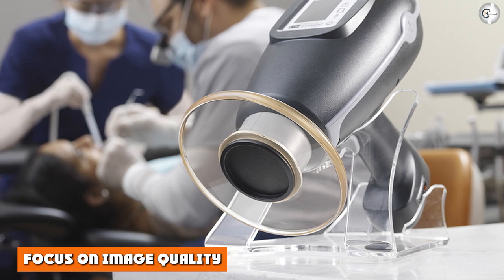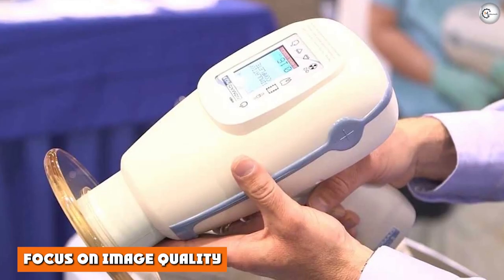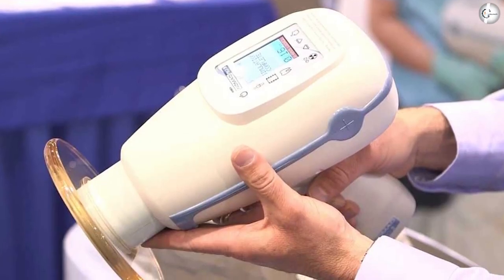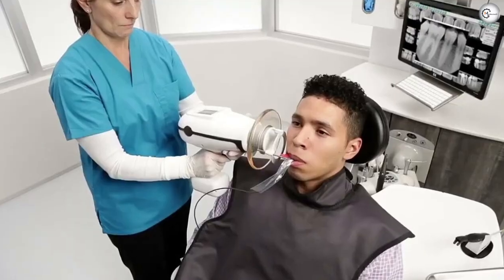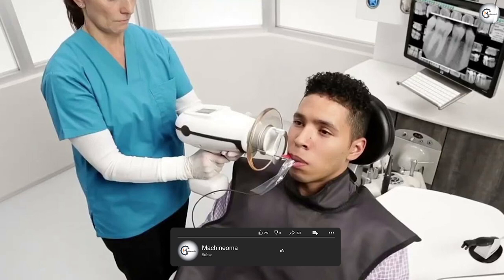Focus on image quality. We know that you want to render the best diagnosis to your patients, and the best diagnosis starts with the best image quality. You can depend on the Nomad Pro 2 to help produce sharp, clear radiographic images.